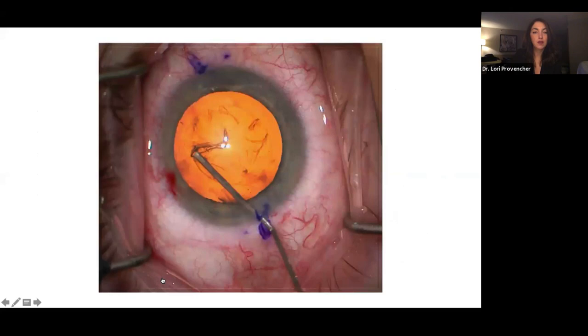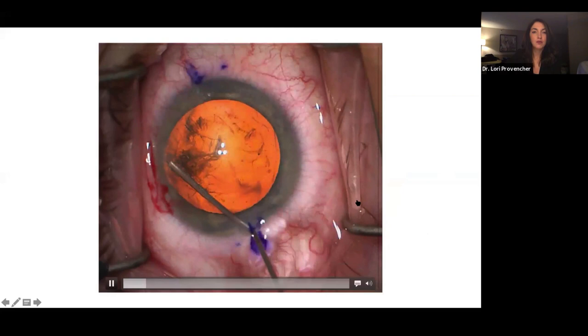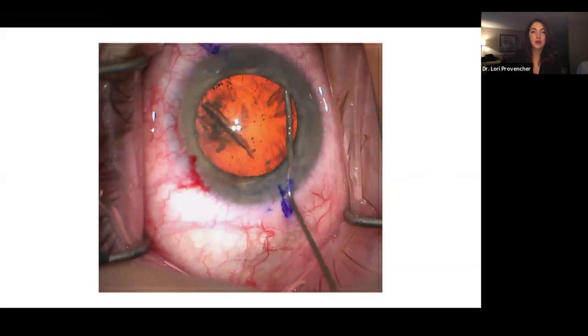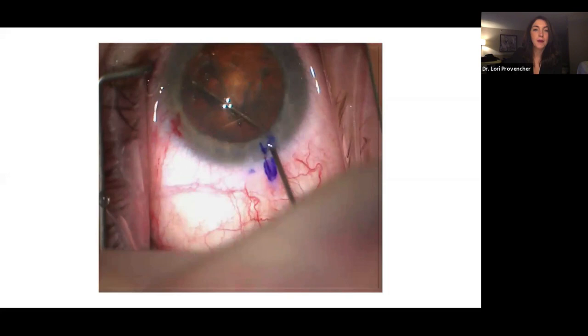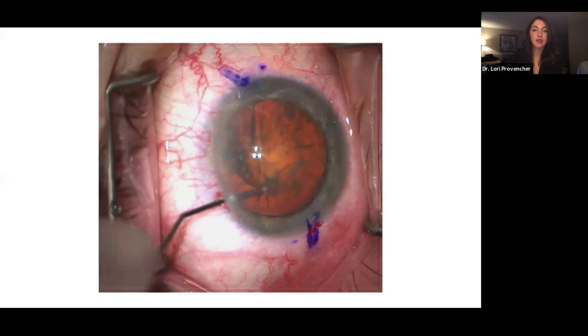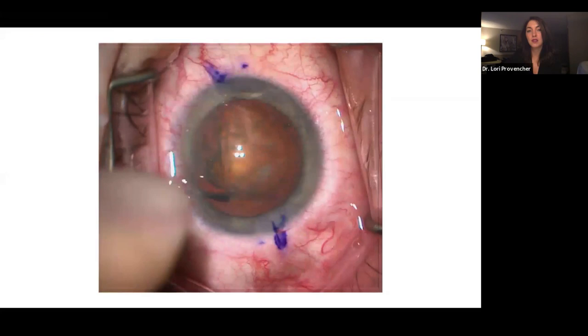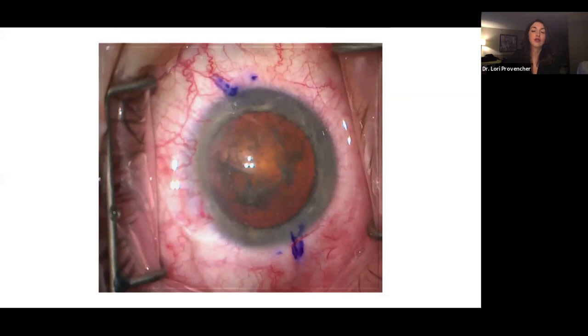I'll show you a video of that. This is just from this week in the OR. So I'm doing my first wave here. I'm just under the rexis edge, blotting down, going over here, doing the other half. Didn't get quite as good of a wave. I'm trying to spin a little bit. I might as well do a little hydrodelineation while I'm there. And I try and go back over here again, and the lens really isn't spinning great. So I go in through my paracentesis, and all it takes is just a little bit of sub-incisional dissection. And now the lens is spinning really well.